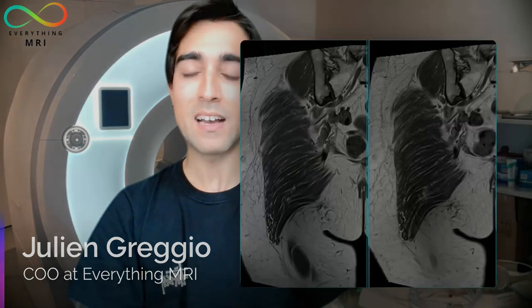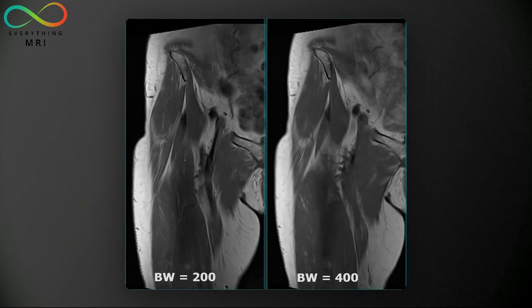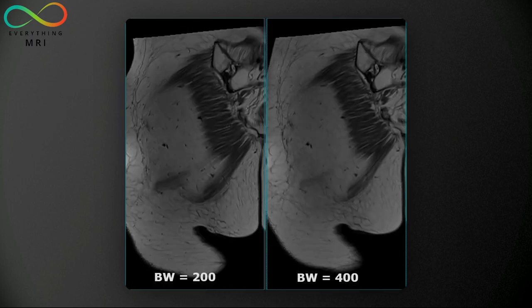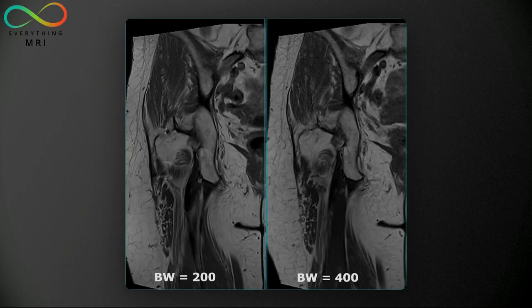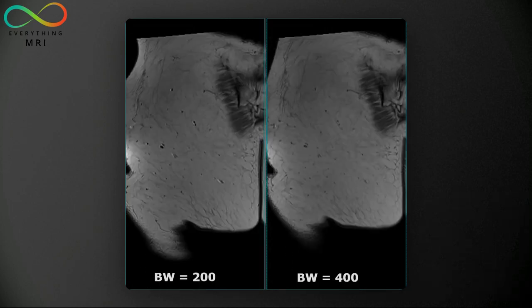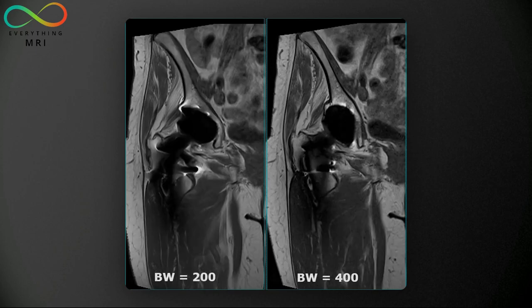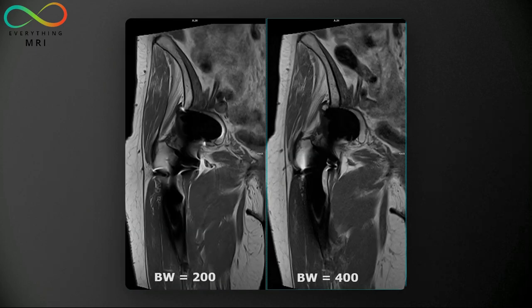Here we have on the left part of the screen a coronal T1 of the hip acquired with a low bandwidth, precisely around 200 Hz per pixel, and on the right part of the screen the same sequence acquired with a higher bandwidth, namely above 400. We can immediately notice that the level of distortion is much less pronounced using a high received bandwidth. We can clearly see the shape of the femoral head and the acetabulum, which appear instead pretty distorted when a lower bandwidth is employed. Also, the signal loss and signal pile-up due to the presence of the implant are fairly reduced at higher bandwidth values.